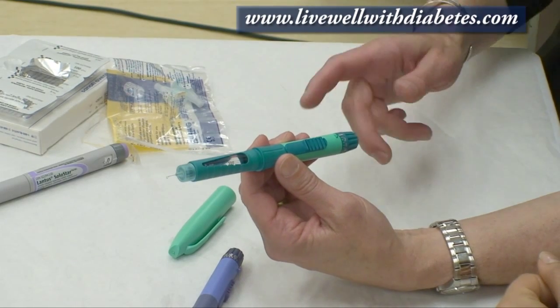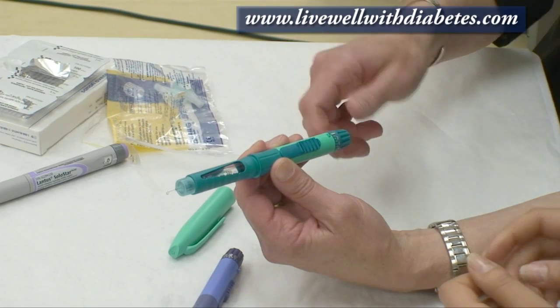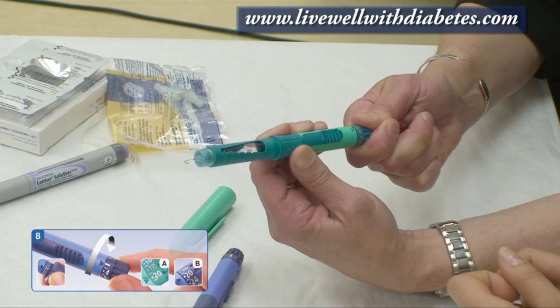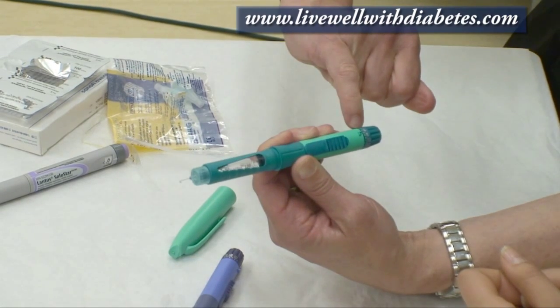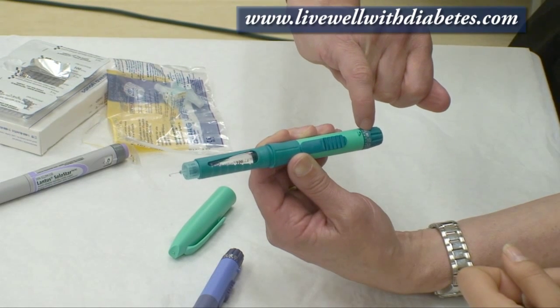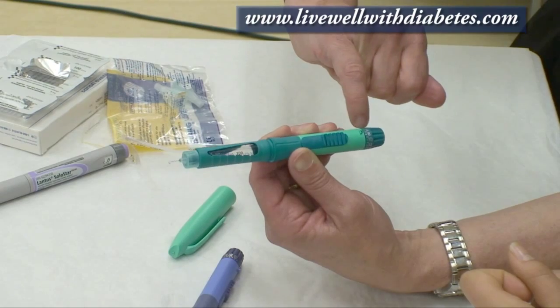Next I'm going to show you how to dial your dose. If your dose is going to be seven, you turn it: one, two, three, four, five, six, seven. All the even numbers have a little dot by them, but the solid line is where the odd number is — so you don't see number seven printed, but it's between six and eight.